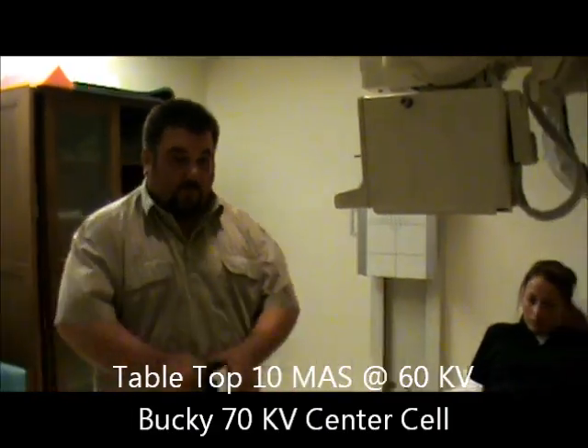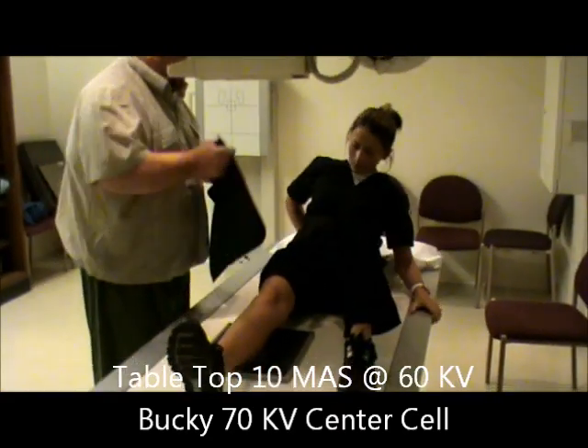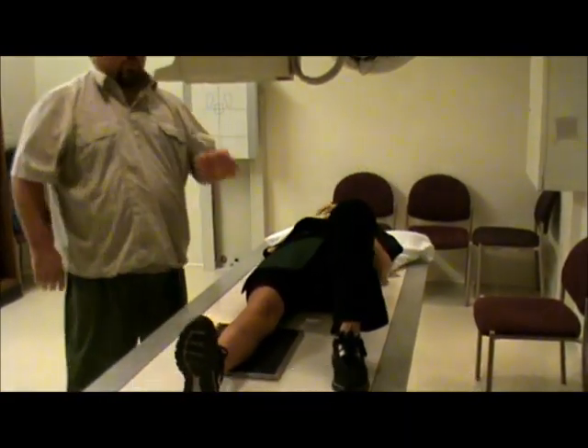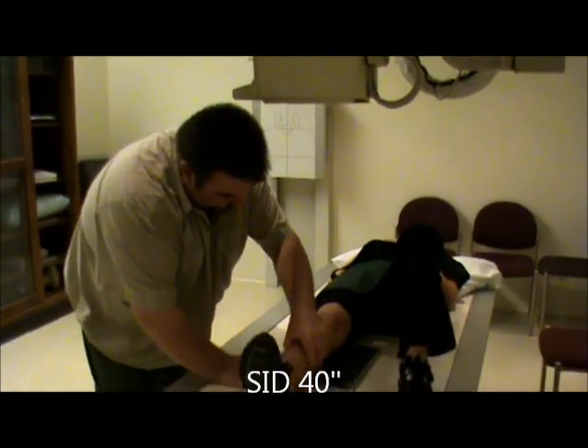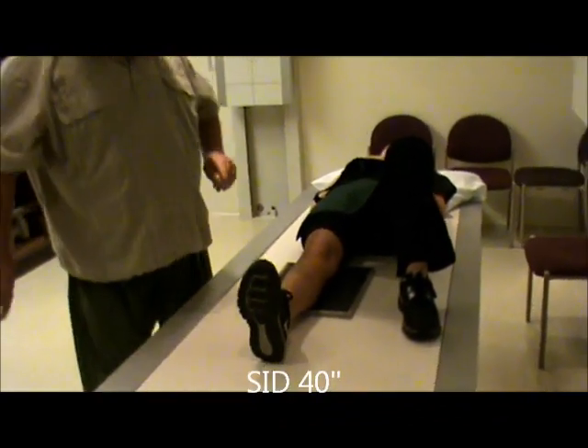We're going to have the patient laying on the table on their back. We're going to place the shield across the patient. We are going to use a 40 inch SID. We're going to place the film in the center of the knee.